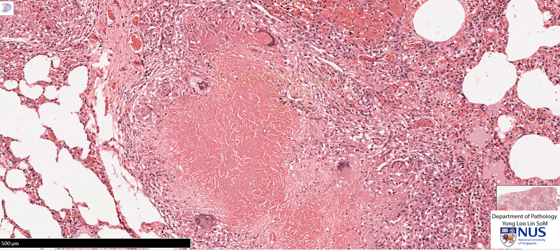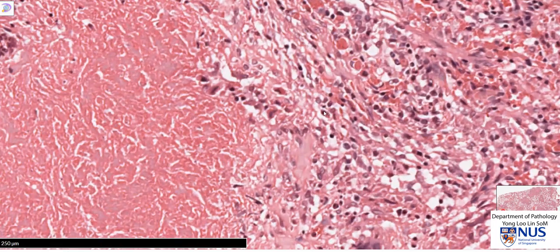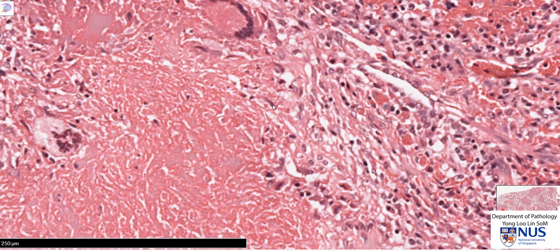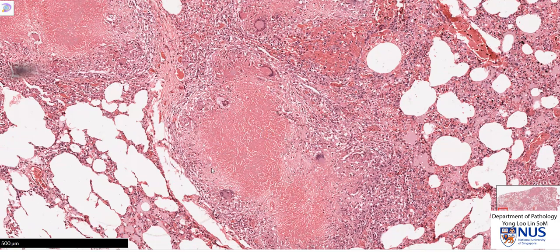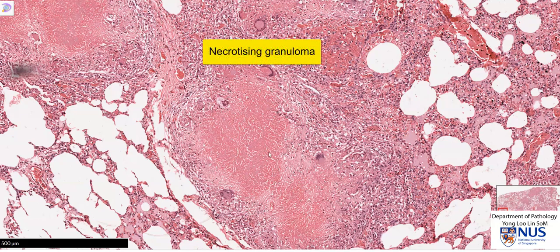There is central necrosis, but around the necrosis there is a cuff of cells, and these are epithelioid cells or epithelioid histiocytes. Essentially, they are activated macrophages, and many of these cells have a kind of elongated nucleus with quite abundant cytoplasm. Because this is an aggregate of epithelioid histiocytes, this is a granuloma. And because there is central necrosis, this is a necrotizing granuloma. The process here is necrotizing granulomatous inflammation.